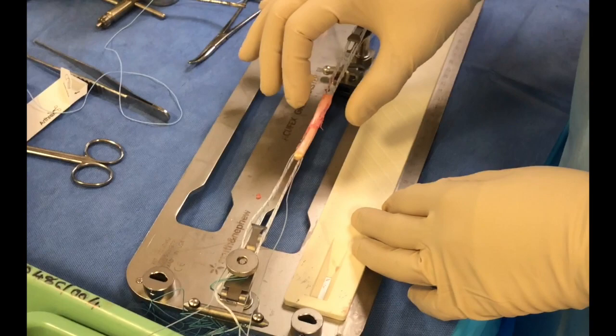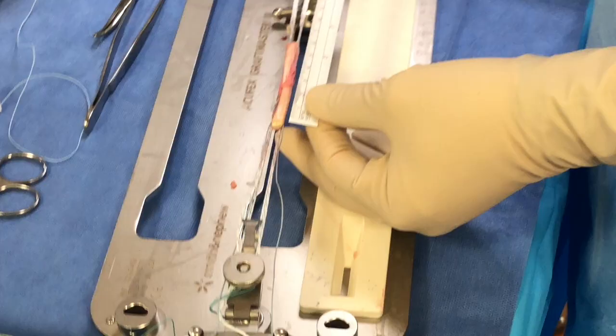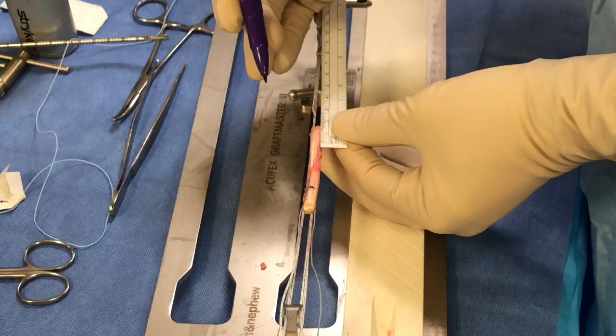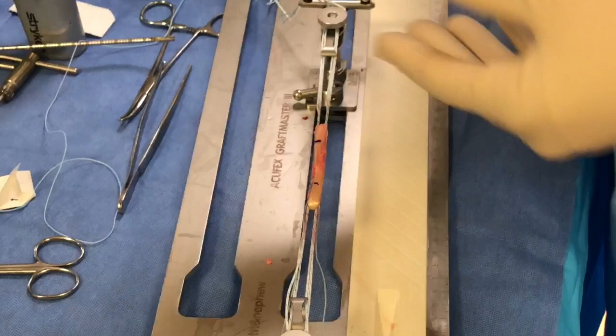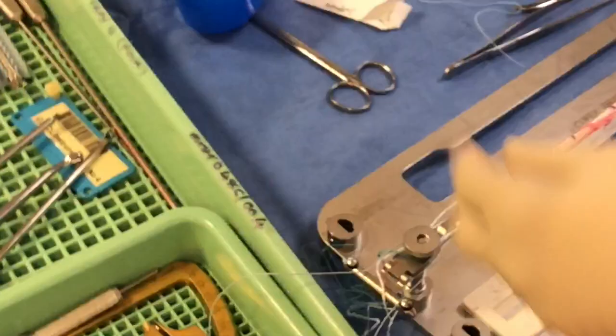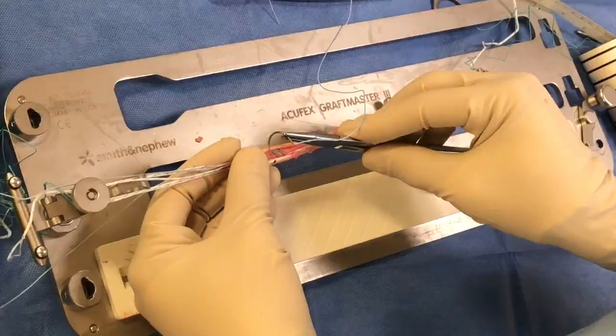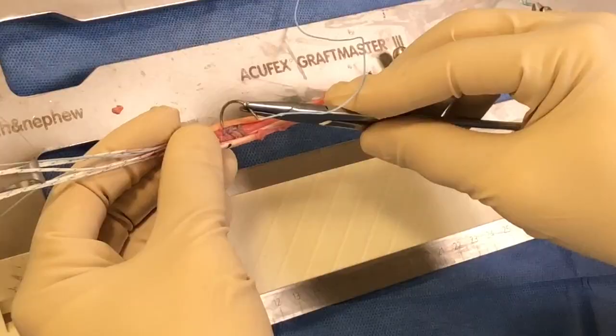The next step is to fix both ends with a fiber wire suture. I want to have 3 centimeters clear in the center, so I'm going to mark each end at 1.5 centimeters — these are where I'm going to put my fixation sutures. This is probably the next most important part of the procedure. The idea is that when you pass the suture, you want to incorporate all the strands into your fixation. The simplest way is to begin in the center.